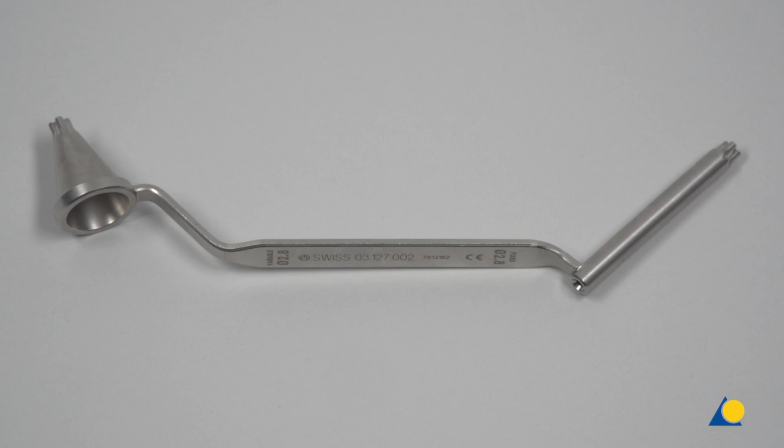For VA locking screw insertion, the variable angle double drill guide is used, at either the conical end for variable angles or the cylindrical end for fixed angles. Note that the VA double drill guide 3.5 cannot be used to measure screw length.